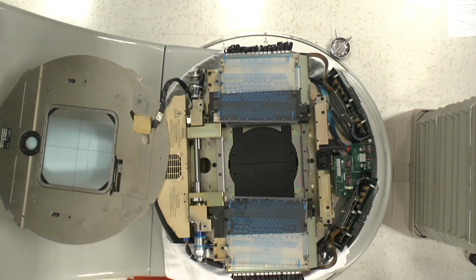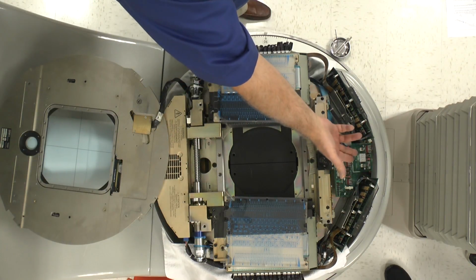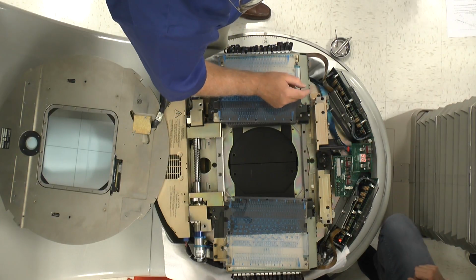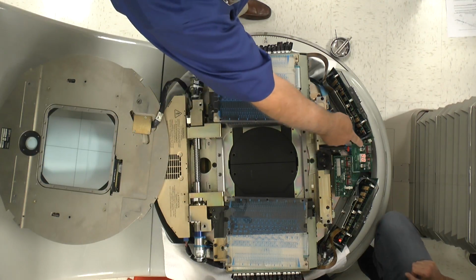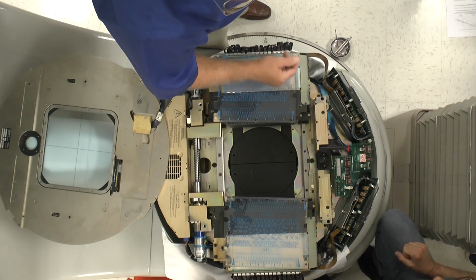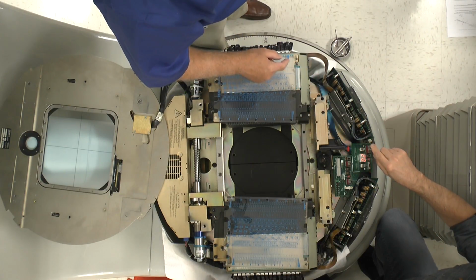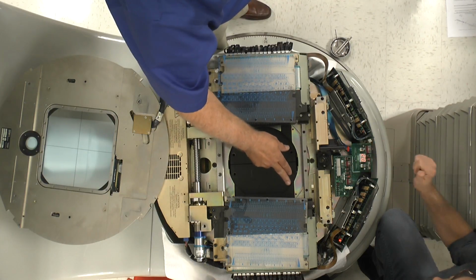Okay. So go ahead and turn the power on. Flick it over to the A side, the switch here. Okay. Which motor did you replace? I did number 2. Okay, so do the 2s. And we want to extend it, so we want to move it up. So push this one up. Push it back. That's good.